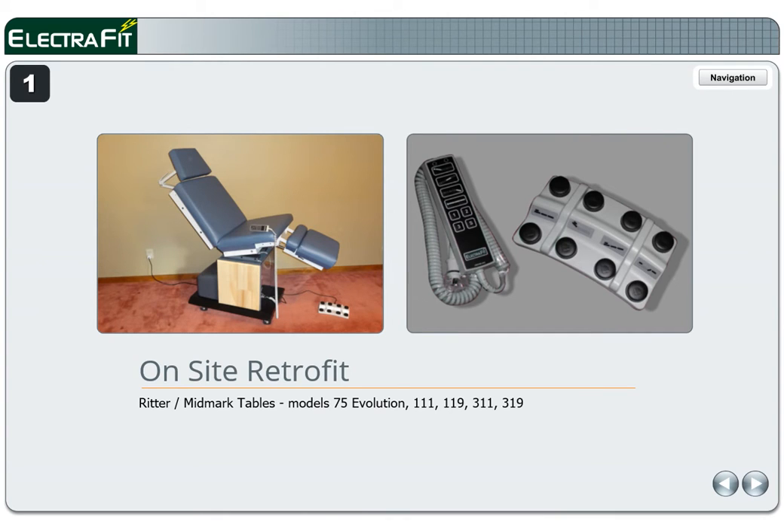This is the on-site retrofit guide by Electrofit Systems for Midmark and Ritter Model 75 Evolution, 111, 119, 311, and 319 Power Procedure Tables. At Electrofit.com there is the online retrofit guide with a printable version at the end of the guide.